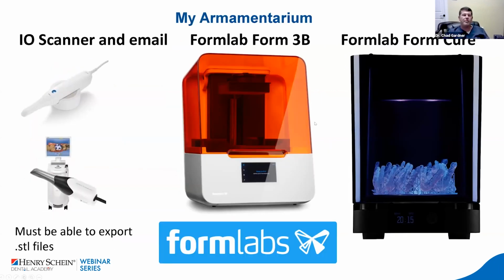My armamentarium, personally: intraoral scanner and email is my main one. Right now, using the Cerec Omnicam for most of it, and send it to InLab and have the STL export license for my five-axis mill, or I can send the STL to my printer. Then I have the Formlabs Form 3B and the Formlabs Form Cure.